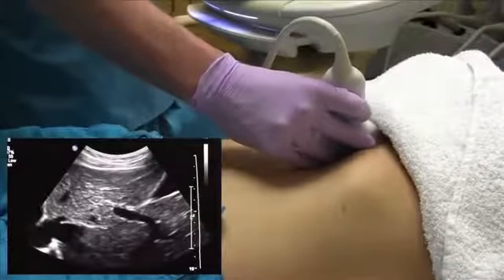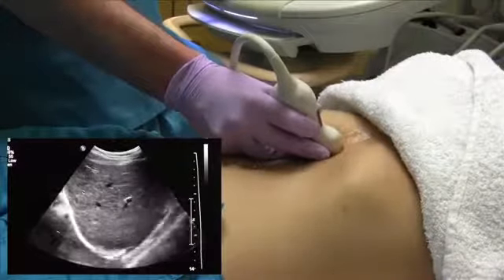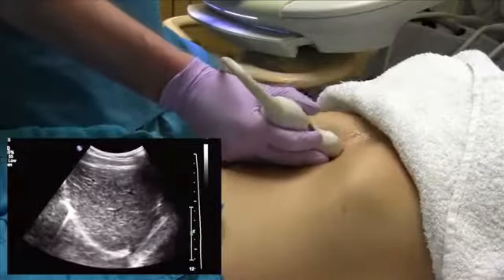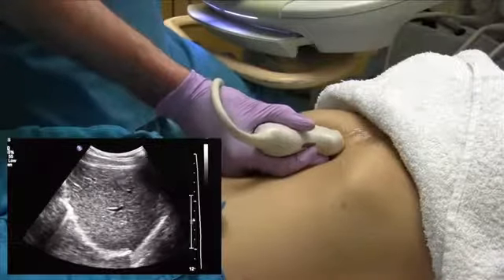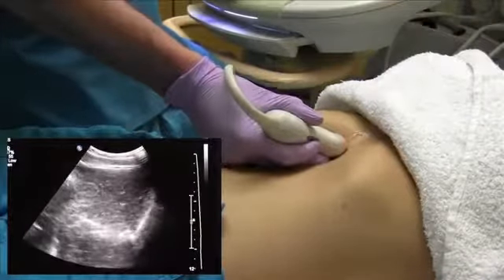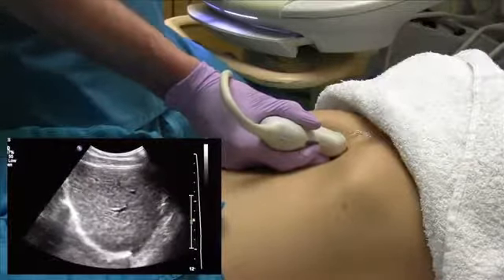And for that, I kind of follow this rib down a little bit. So technically, you're slightly obliqued. And what you want to make sure you do is you're pushing in and angling up underneath this rib. And what I do is I start at the dome of the right lobe and then take sequential pictures as we come down. So the first picture I get of the right lobe is just the parenchyma.